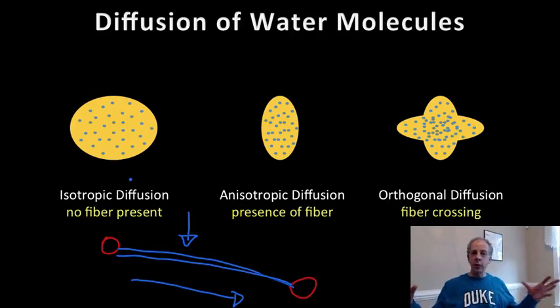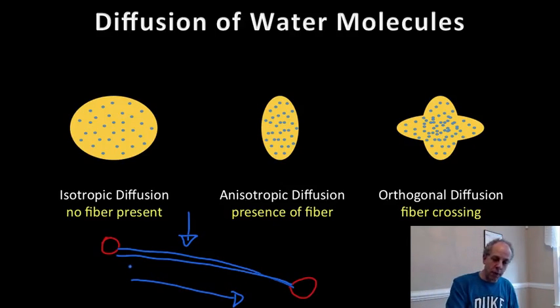So for example, if we try to diffuse the water and it goes in every direction, there's basically no cables. If we try to diffuse the water and it goes in every direction but one, basically there is a cable in kind of the orthogonal direction, in the perpendicular direction. So if it goes every place but it just has real difficulties going in this direction, then something is stopping it in this direction. So it's kind of the perpendicular direction.